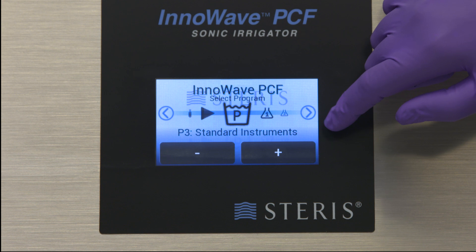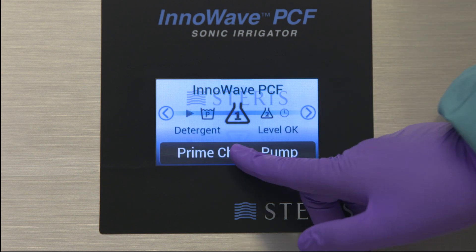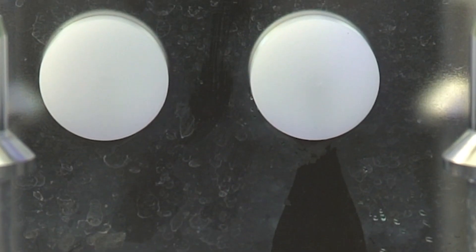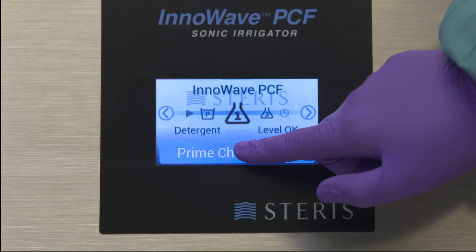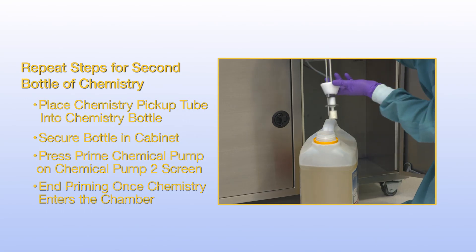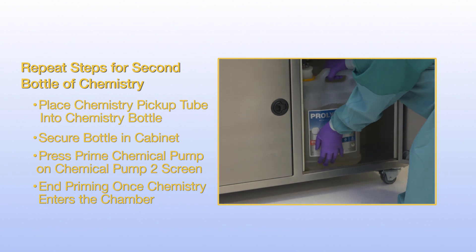Use the arrow keys to locate and select the chemical pump 1 icon. Press the prime chemical pump button to begin priming. Look inside the chamber at the chemistry inlet — once you observe chemistry coming into the chamber, press the prime chemical pump button again to end priming. Repeat these steps if you are adding a second bottle of chemistry or a lubricant.